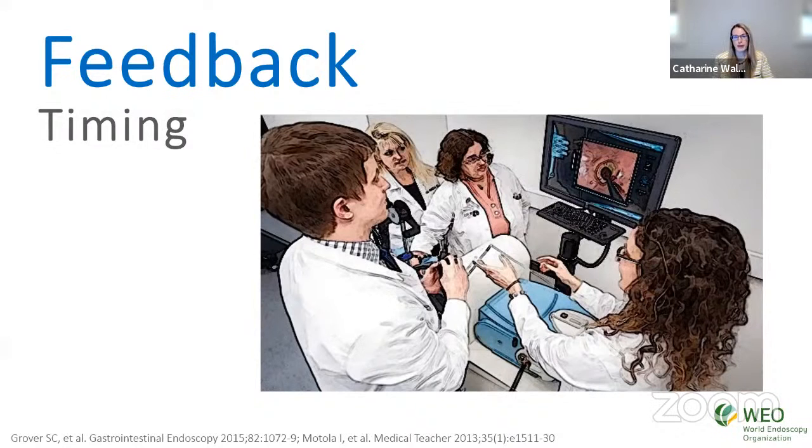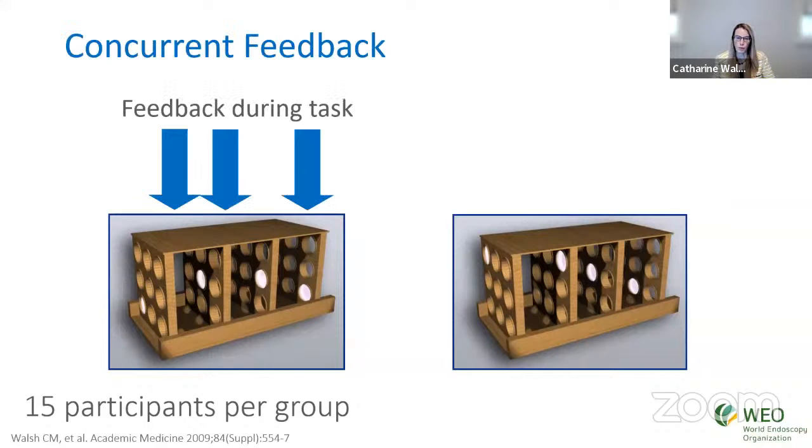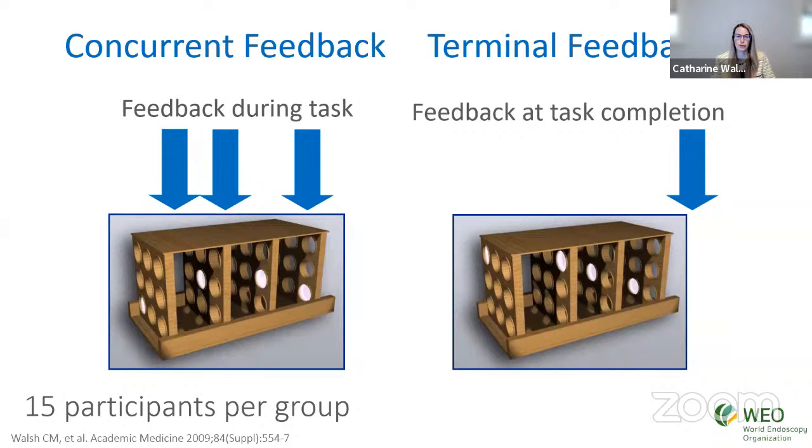So not only should feedback be provided, but it should be provided in the most beneficial and effective way. One thing that this relates to is the timing of feedback. We had done a study to look at this, and we had randomized participants to 2 groups. Again, they practiced on this very simple low fidelity simulator. They carried out 15 trials on the simulator, and one group received feedback as they were doing each of the 15 tasks. There was a teacher there giving them feedback as they were performing the endoscopy tasks, whereas the other group received terminal feedback.